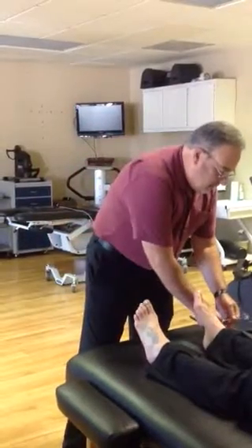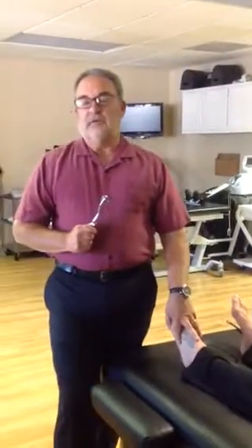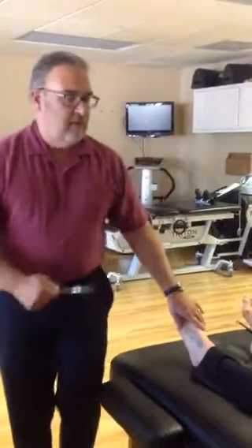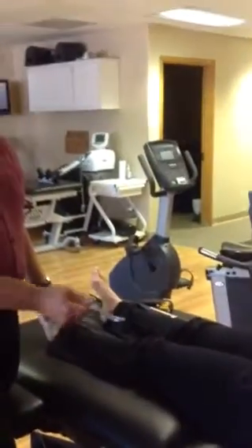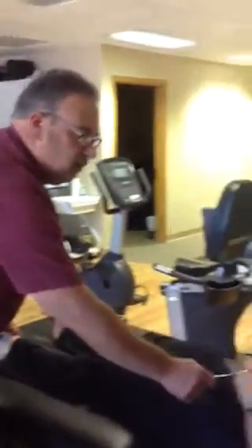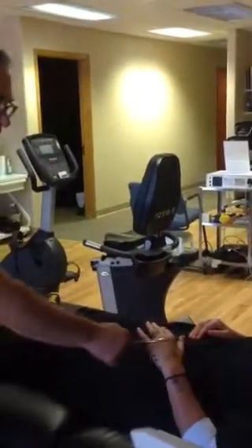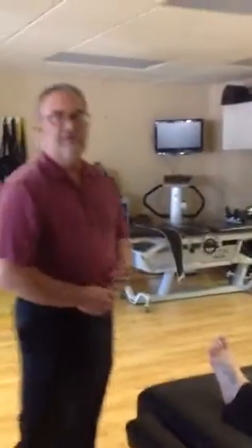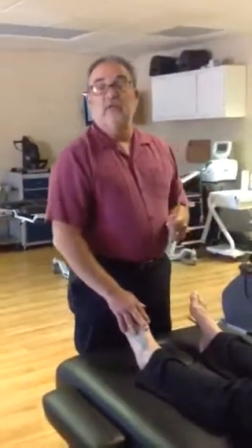In neuropathy, sometimes sensation becomes hypersensitive. In the beginning, the brain actually starts putting more sensation to the foot, so it becomes hypersensitive, and then finally says we're done and it becomes more numb. So some of you right now are very hypersensitive to touch — it's the brain trying to fix things but not knowing how. We run the pinwheel through different dermatomes, nerve parts of the body. I'll go over the hand and give it a number 10. If she felt it more or less in the foot, I know she has a neuropathy issue.